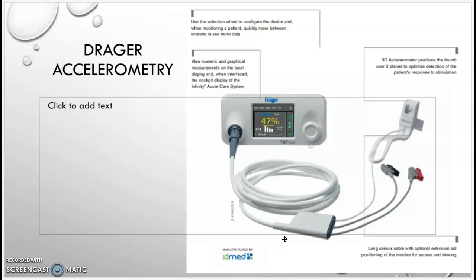Then he took me to the storeroom and I found this device sitting there, looking like nobody had used it for a long time. And then he showed me how to use this device. And I thought it's pretty cool. It is giving a train of 4 ratio from 0% to 100%. And when I push some rocuronium, the number goes to close to 0. And we wait there half an hour, then it again climbs to 70s, 80s, 100.